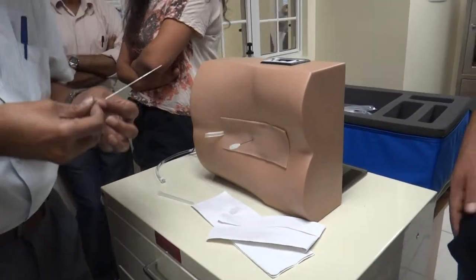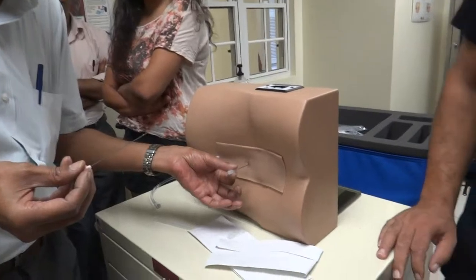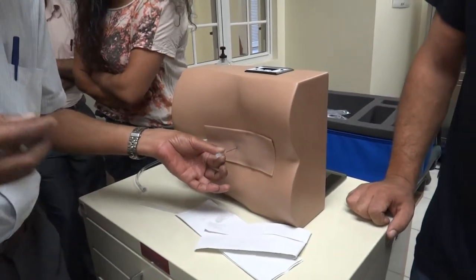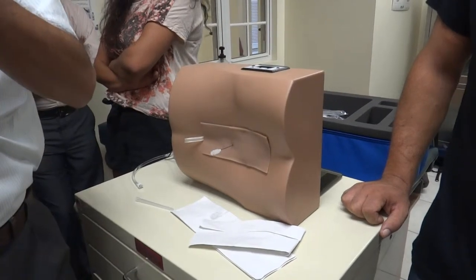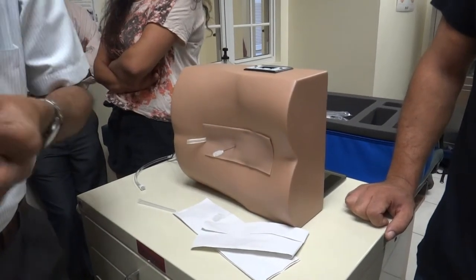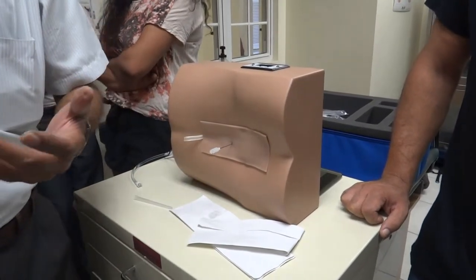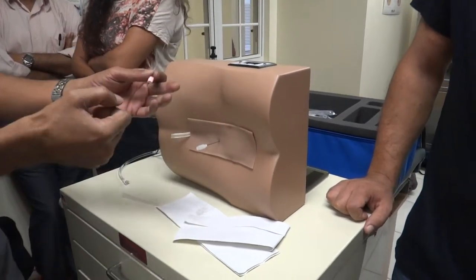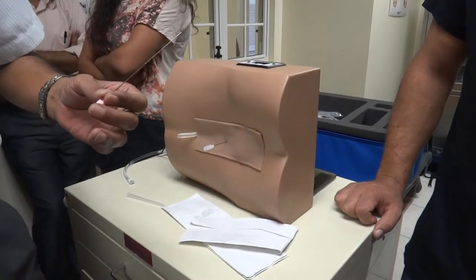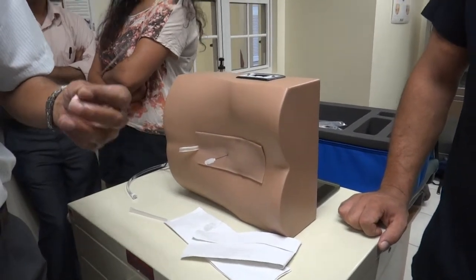If that doesn't work, you can gently rotate it in the longitudinal axis without going in or out. Sometimes a small filament of tissue may block the opening, so when you do that, CSF comes out. The third thing you can do is take the syringe, insert it, and aspirate gently, and you'll see the CSF. These are the three things you can do in an actual situation.